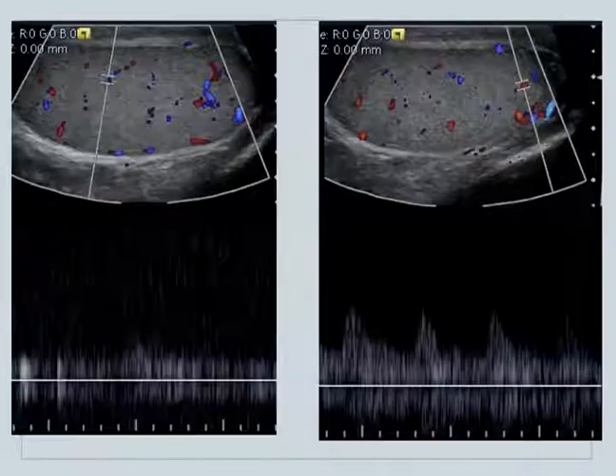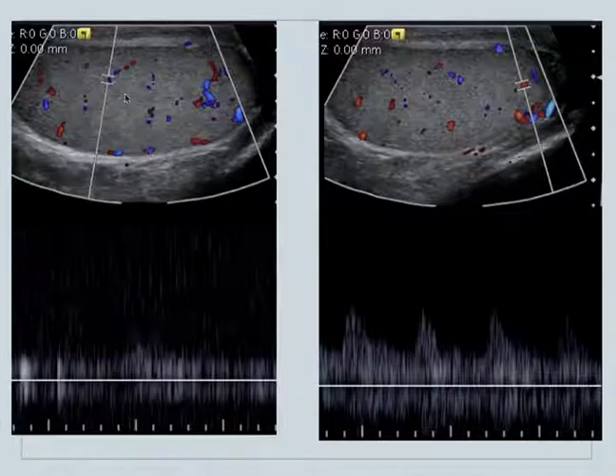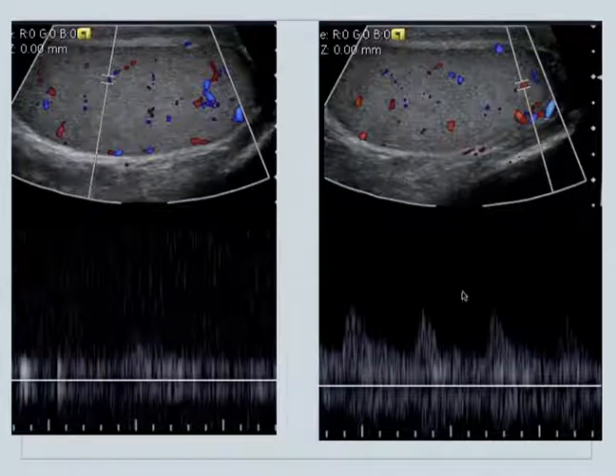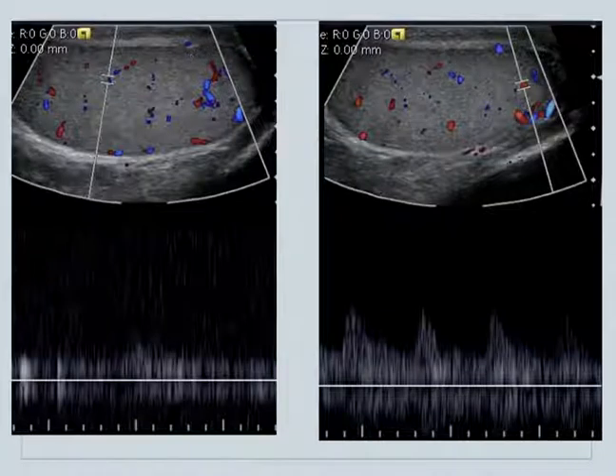Here's another example that's a little bit easier to see. We moved the probe into a sagittal plane, and now we can see blue over here with kind of a venous waveform, and then red here is more of an arterial waveform. This is a normal flow pattern — there's arterial and venous flow seen on this testicle. This is a Siemens Acuson machine.